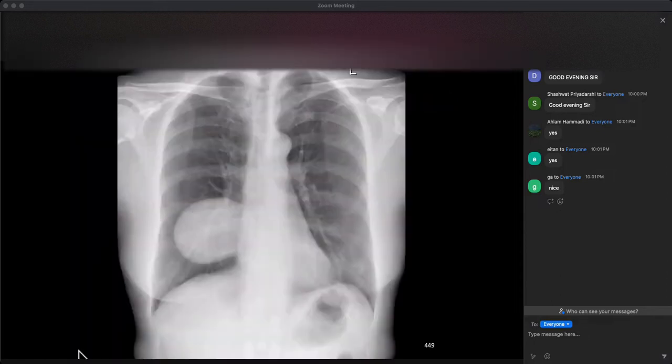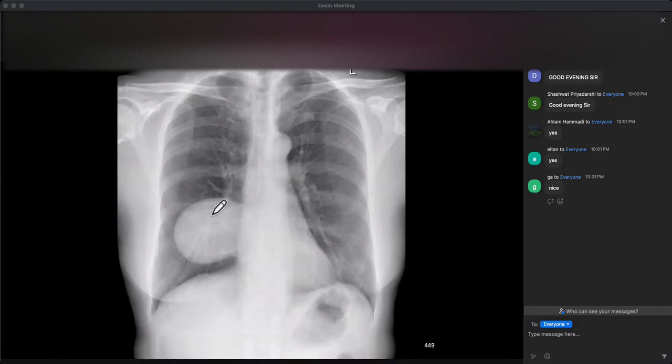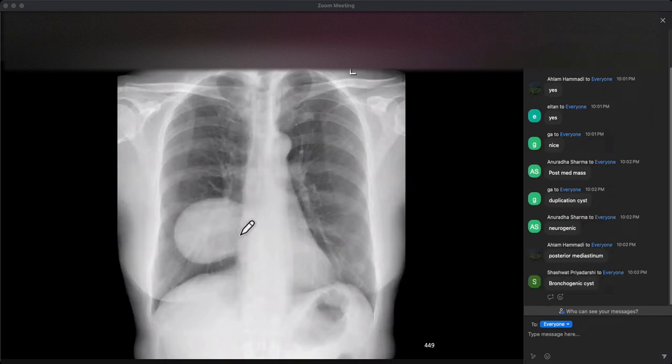Okay, let's get straight on to this then. We've got a patient who has got an incidental finding of a mass lesion projected over the right midzone. You can see the right heart border, and you can see the blood vessels coursing through the lesion. So the blood vessels are either in front of or behind the lesion, but because I can see the right heart border, that tells me that the lesion cannot be anterior.